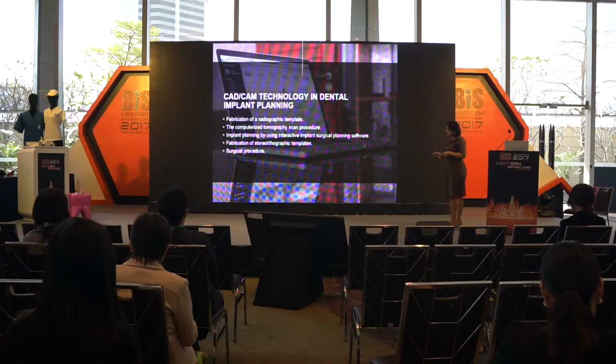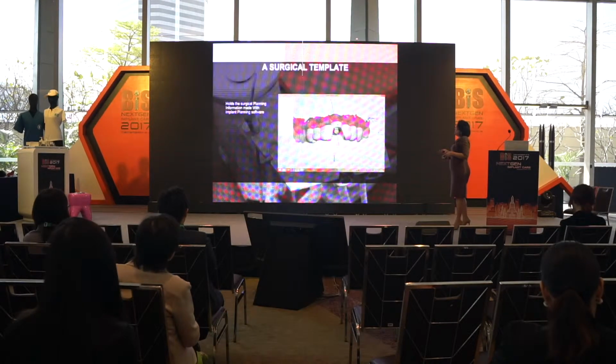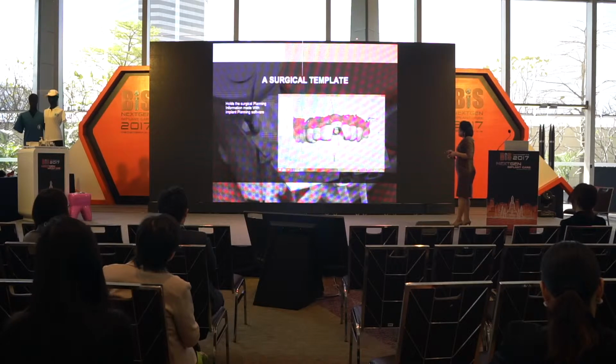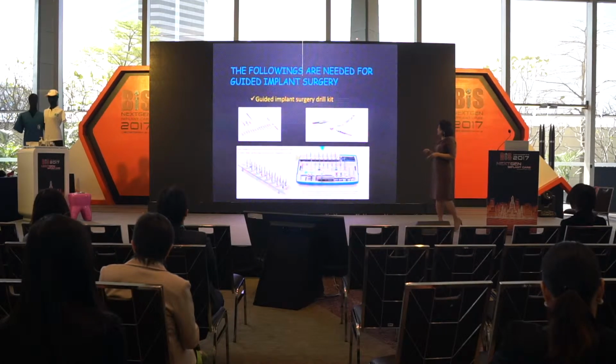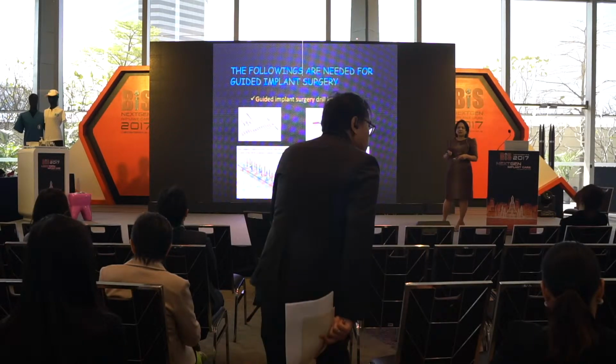You can make a surgical template and fabricate the provisional crown or bridge. To do the planning, we have planning software to make the surgical template in many software. If you want to use guided surgery, what data should you know? What do we need for guided surgery?